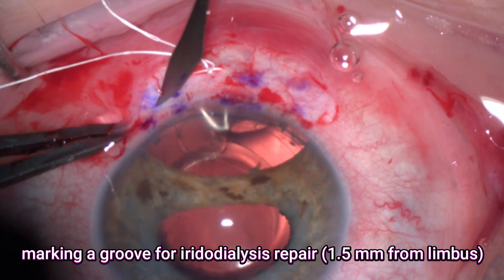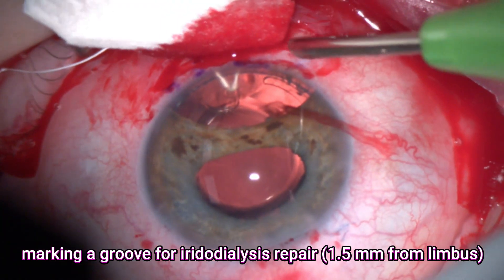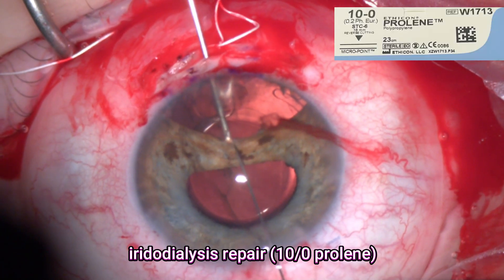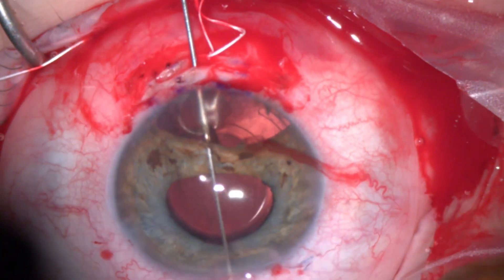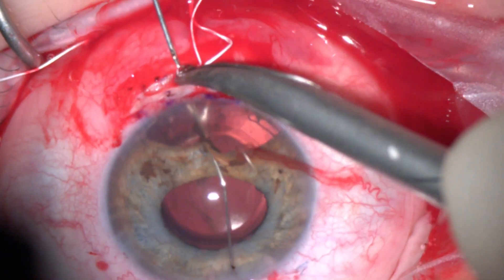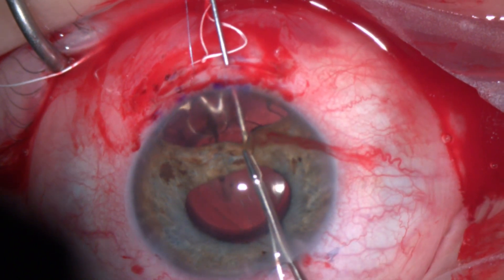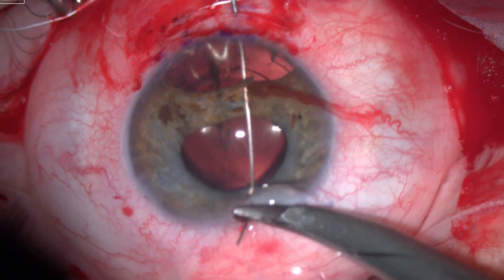The next step is to prepare for the iridodialysis repair. I made a groove in the sclera — just a partial thickness groove about 1.5 millimeters from the limbus. Good cautery is essential now. Then I will use a double-arm 10-0 polypropylene suture to repair the iris. Here I'm using a 30 gauge needle just to make a very tiny track through the sclera, also using a secondary instrument to help get a small grip of the peripheral iris, then docking the needle again through the 30 gauge needle.